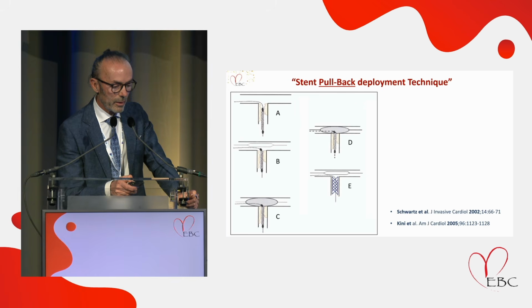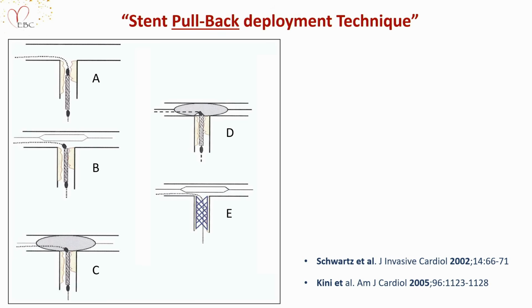28 years ago, they presented this technique. This is the stent pullback deployment technique. It's still valid now. So you go in A, the stent is positioned in the circ. You put a balloon in the left main.